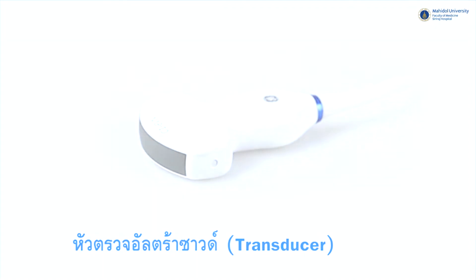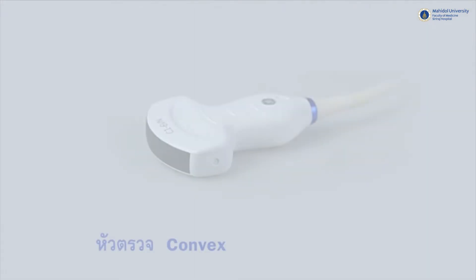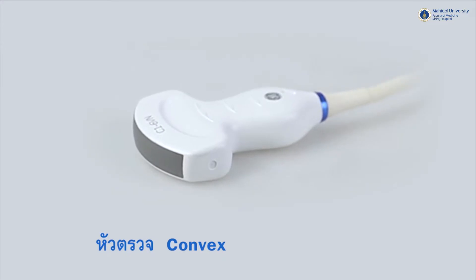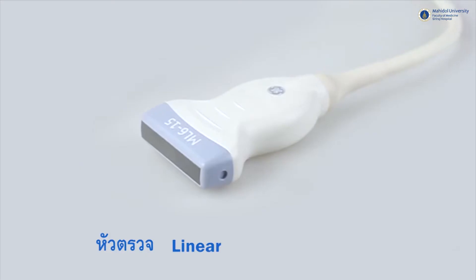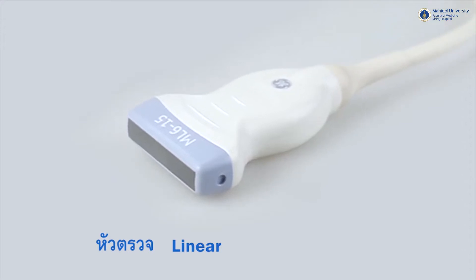Generally, the commonly used transducers are the convex probe, which has a convex shape and frequency of about 3 to 5 MHz, used to study abdominal organs. Next, the linear probe, with a flat shape and frequency of about 6 to 15 MHz, is used for superficial organ exams like breast or thyroid gland.